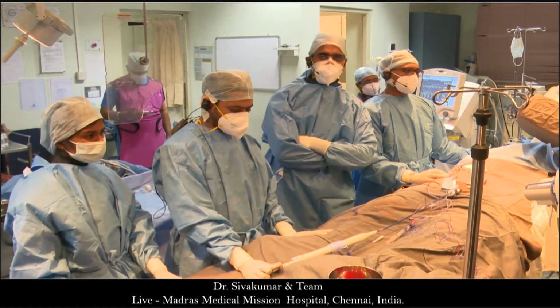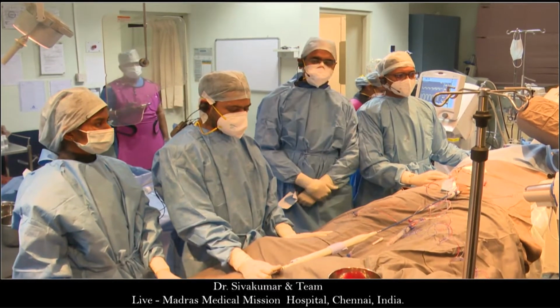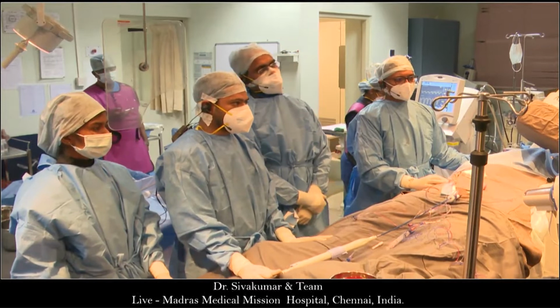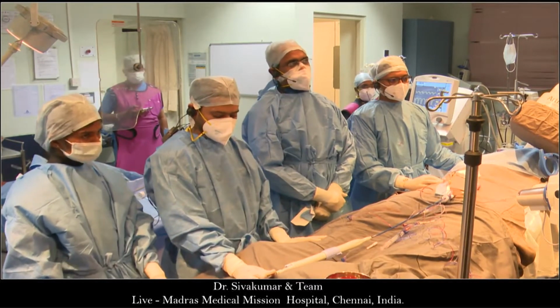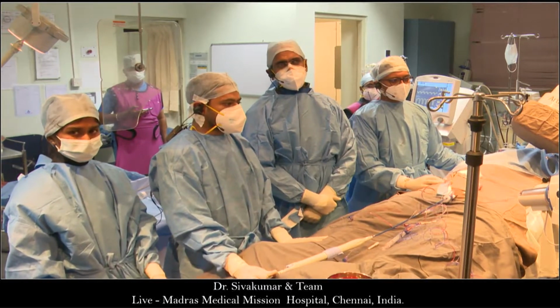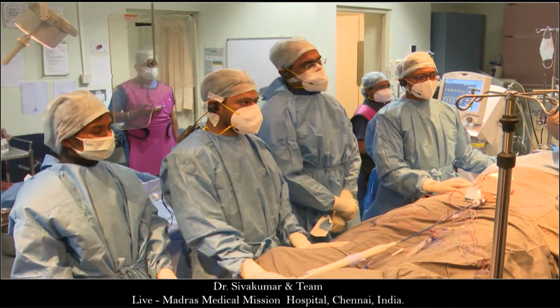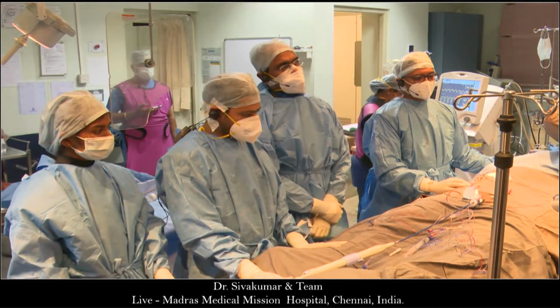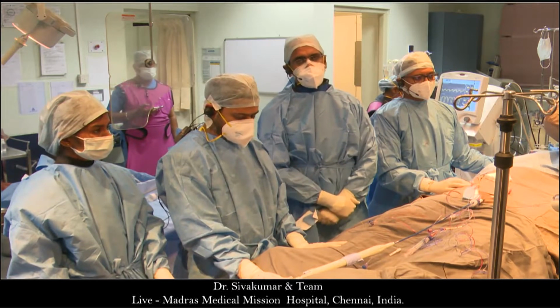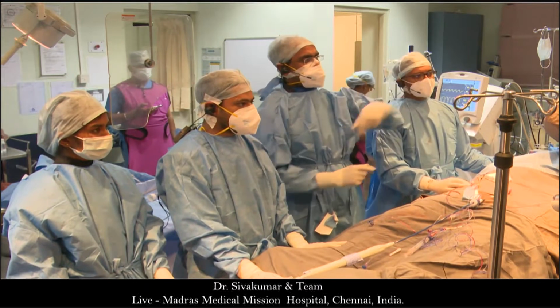Hi, Mario. I have here Dr. Gaurav and Venkatesh, who are doing the preliminary work. As pointed out by Dr. Fareen, the right femoral vein was occluded during the previous surgery. And so we had to go through the left femoral vein, and for the control PA angiogram, we have the right jugular venous access. Can you show the angio now?